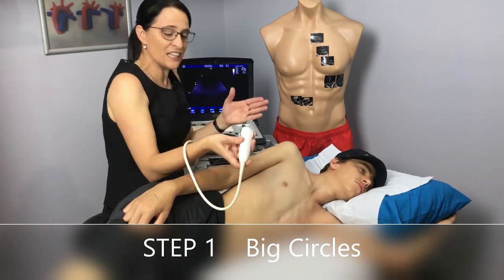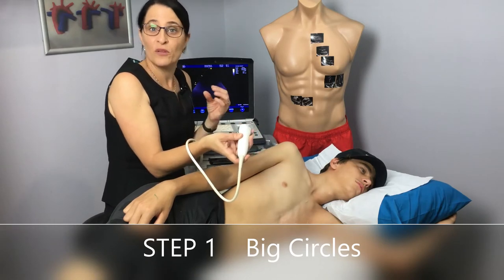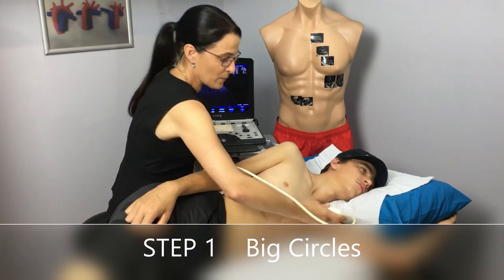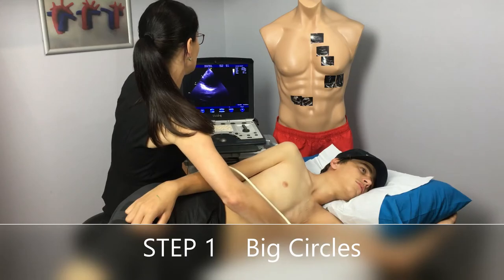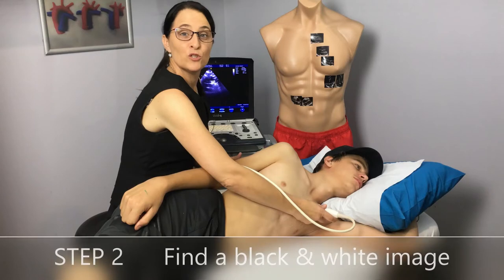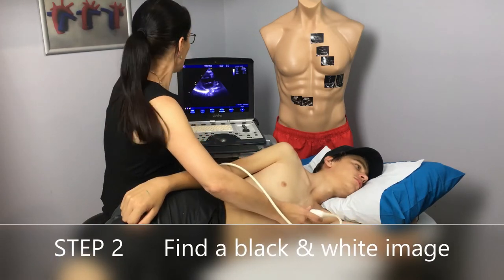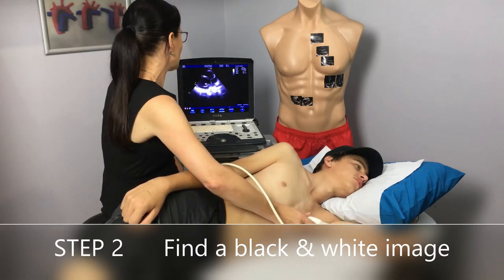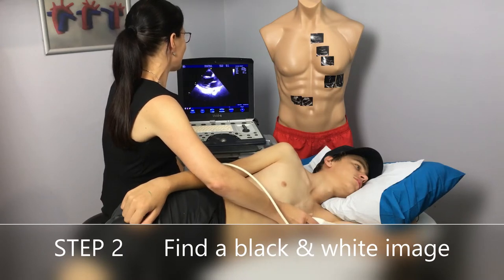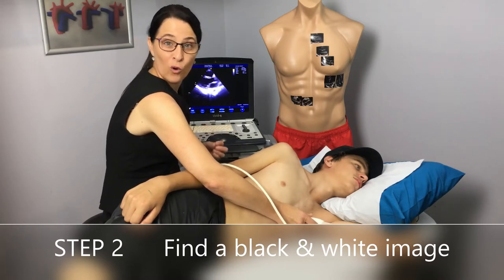Sometimes, particularly on female patients, it's not possible to do these large circles, and I would then go for a stripe approach — that's step number two. Find a black and white image. This is where we look for a keyhole through to the heart, where the blood pool is black and the tissue is white. This picture may not look like the ideal parasternal long axis just yet, but you are almost there.